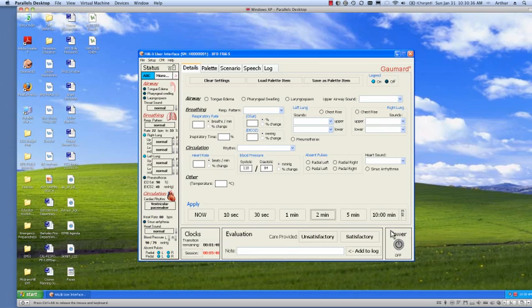When you're done, right now the power is off because I don't have a mannequin attached, this button would normally be green. You can go ahead and just push the power button to off, and that will keep the mannequin asleep but not turned off, so it's ready to go for the next one when you go forward. Okay, hopefully that's good information to get started with.